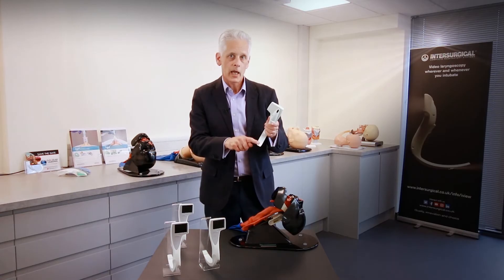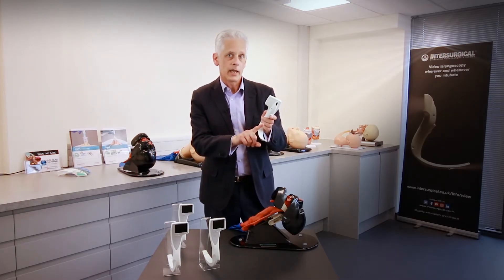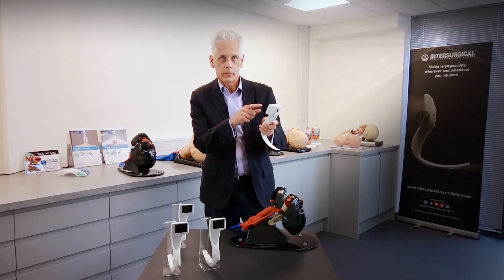The advantage of having a Macintosh blade is that unlike devices which have a hyper-angulated blade, with iView you can use the device for both direct laryngoscopy as well as video laryngoscopy.